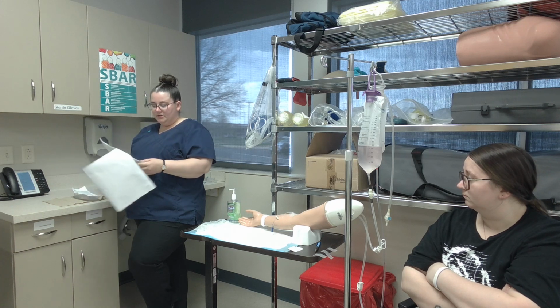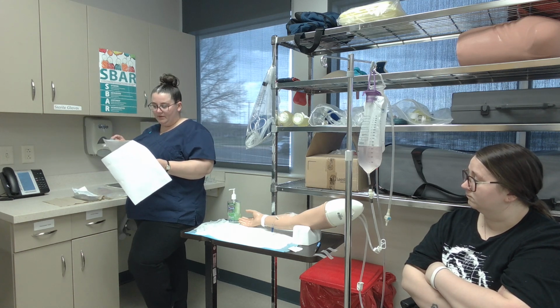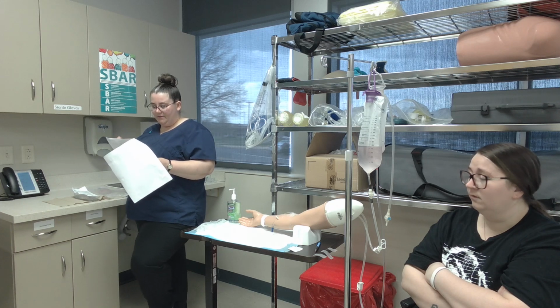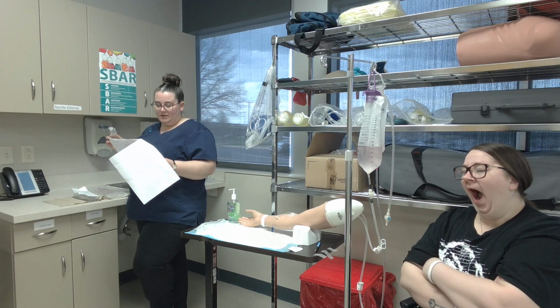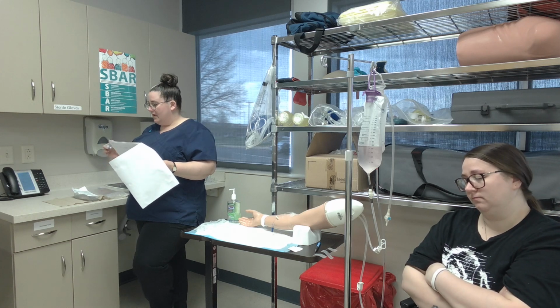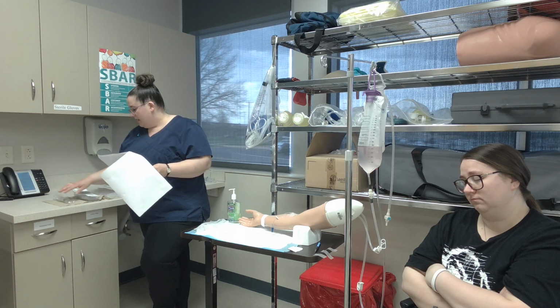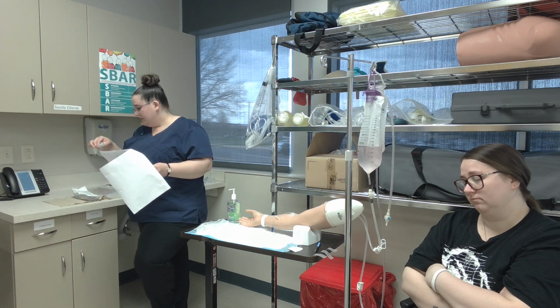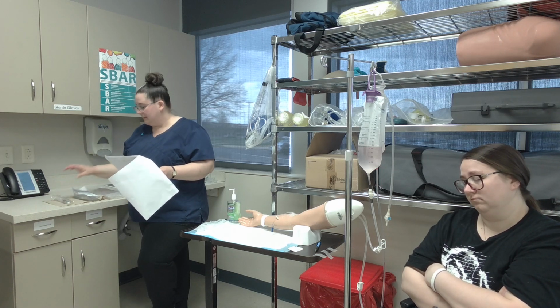Normal saline flush, 3 ml. Normal saline flush, 10 ml. So I will only be giving 3 ml IVP PRN for IV patency. The status is active, and this med has not yet been given. I will be giving it at 10:45 a.m. And packaging is good. Expiration is 12/24/26, and no particulate matter or crystallization.